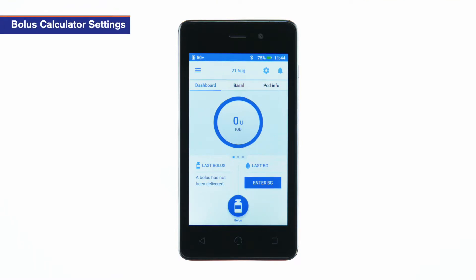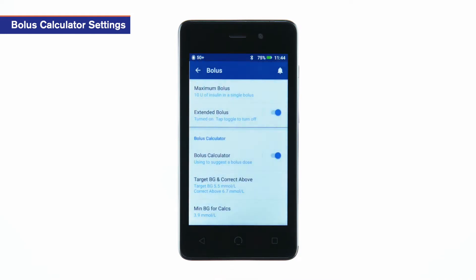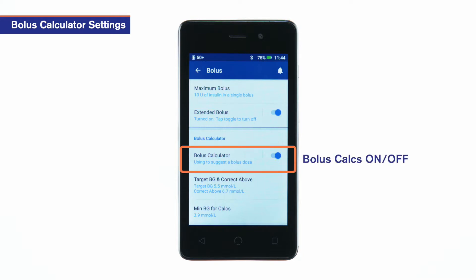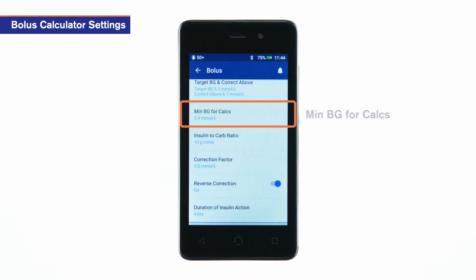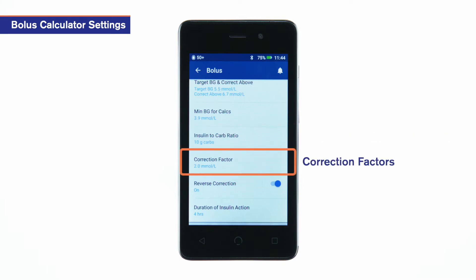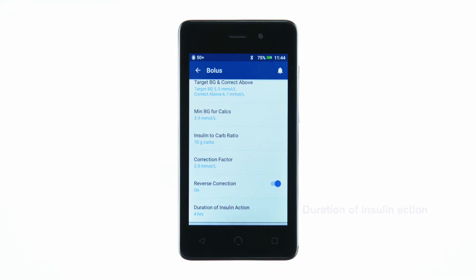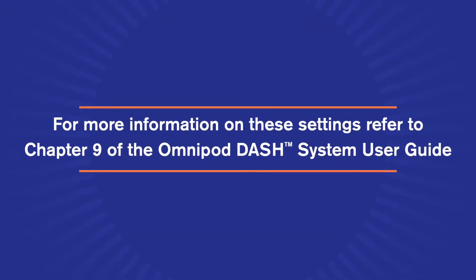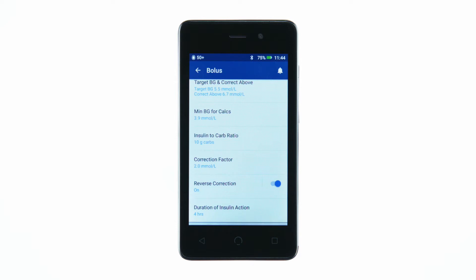The bolus calculator settings can be found in the menu under settings. Find and tap bolus. Here you can change any of your settings related to bolus delivery. For example, you can turn the bolus calculator on or off, edit target BG values, change the minimum blood glucose value allowable for the bolus calculator, change insulin to carbohydrate ratios and correction factors, turn reverse correction on or off, or edit the duration of insulin action. Let's go through how to edit some of these main bolus calculator settings.